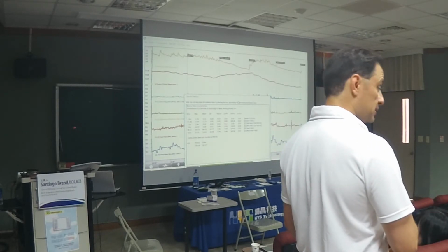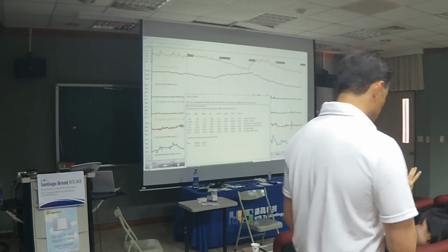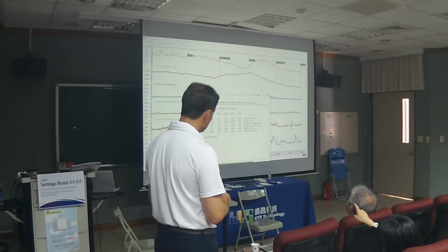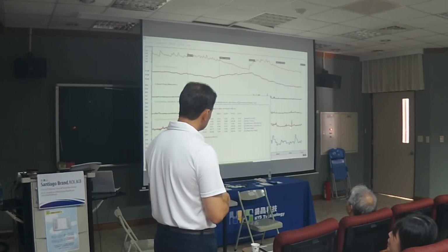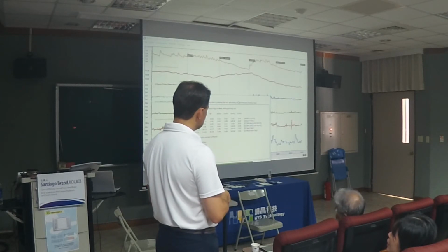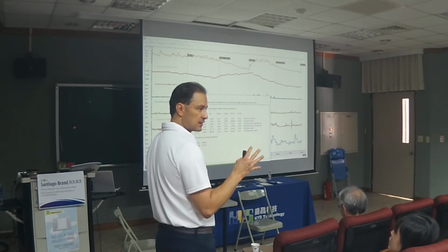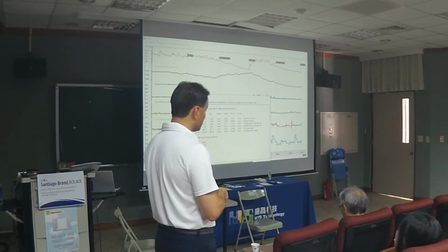All right, so is that clear? Is that good? Hi, Santiago. I have a question. Yes. It's still a recovery phase 2. Yeah. So do you think we need to do some artifact rejection? We could do. Yeah, that's a good question. What Chen's asking here is about this line here, and that's probably he moved the finger a little bit. That's an artifact. So we can remove that certainly, and we'll change the value.